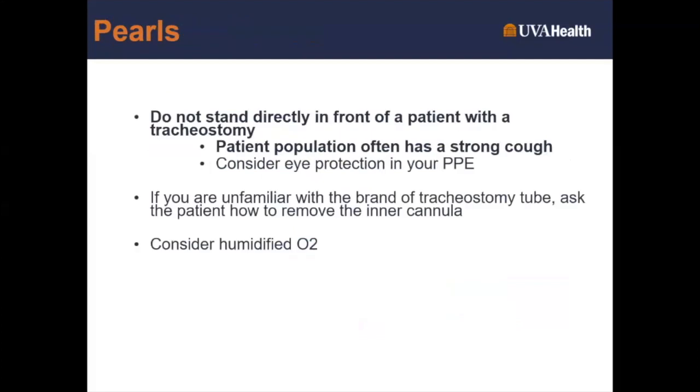Some clinical pearls from Kate: do not stand directly in front of a patient with a tracheostomy. Some of my peers I used to work with learned this the hard way. Even when they weren't standing directly in front of a trach patient, they learned this the hard way. This patient population often has a very strong cough. Now, what do I mean by this?